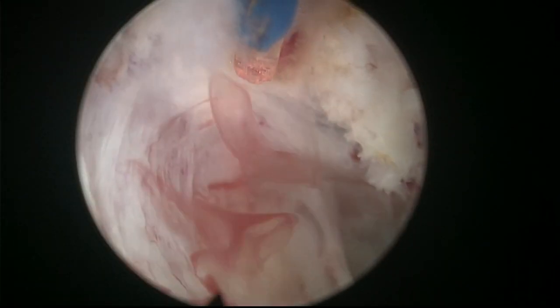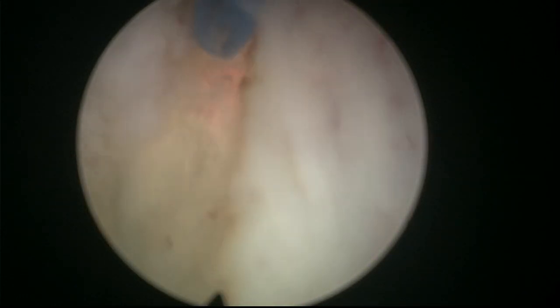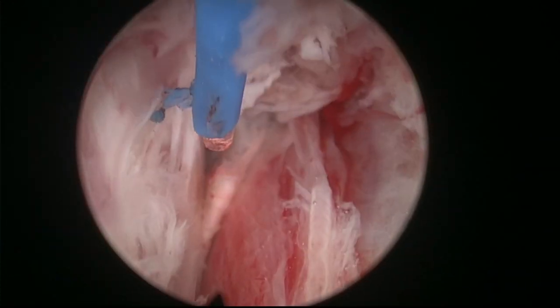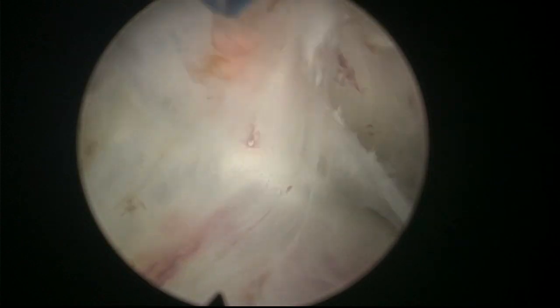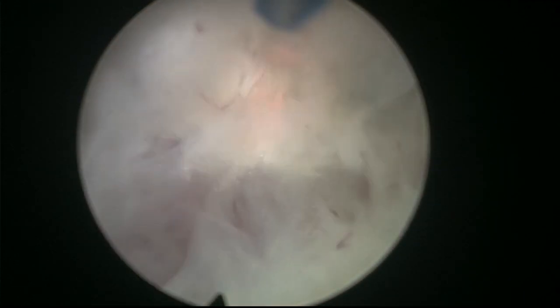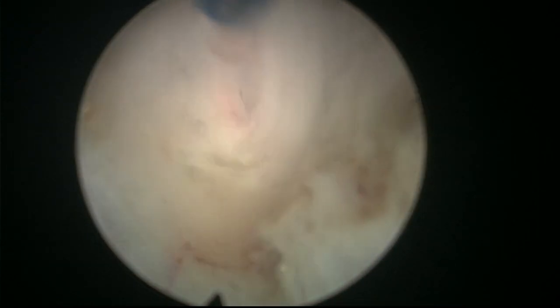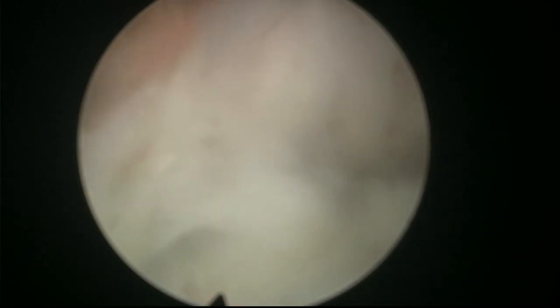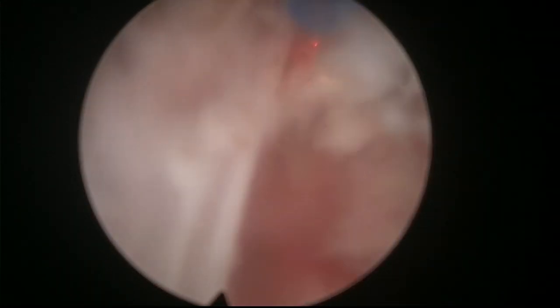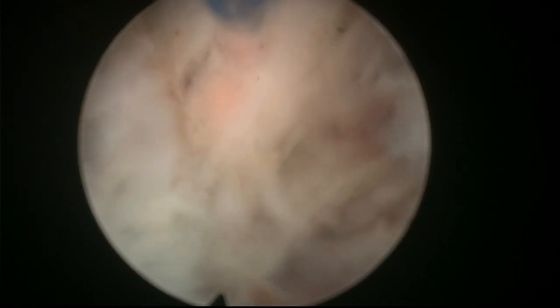When you come up here, you have to continue horizontally to connect with the 12 o'clock region. Let's try to do this dissection coming from below, coming up, coming up. Take your time — you can do this in one pass or in thirty passes, it doesn't matter. When you come towards 12 o'clock, we have to join with the incision we made before. This is the most difficult part of the operation — always the apical liberation.